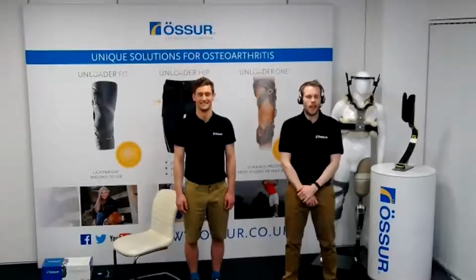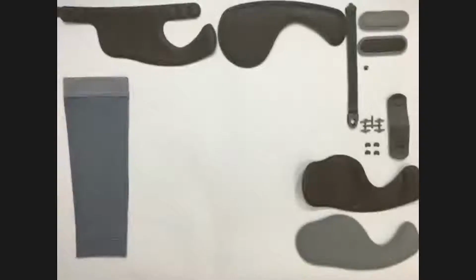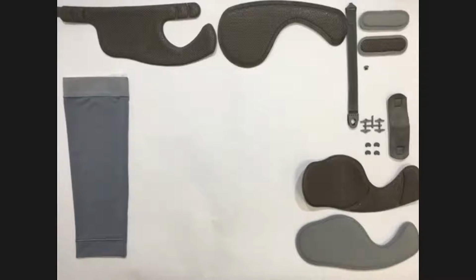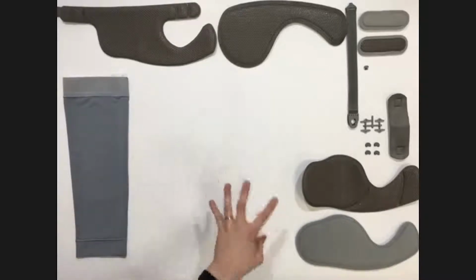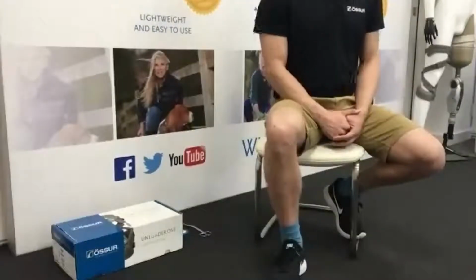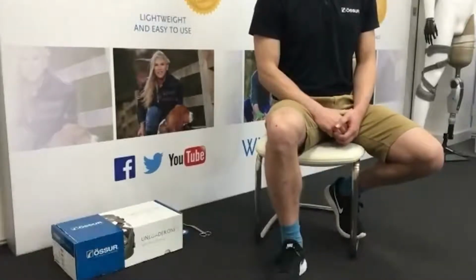And what I'm going to do now is just go over to the table, which is directly over here, and this just shows you the view that I can talk you through the application of the actual system itself. So you can see we've got a variety of different accessories here. There will be an unloader here in a moment. From there, we then go over to the fitting cam, where you can see a view of Pete, and this just means I can talk you through the fitting of the brace and also the fitting of the different accessories.